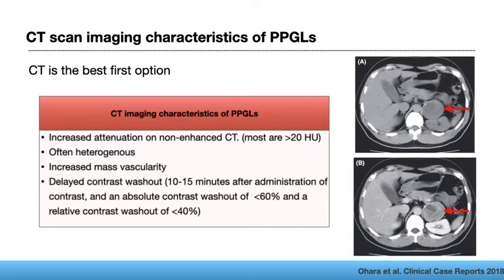The last characteristic is the delayed contrast washout, with the absolute contrast washout of less than 60% and the relative contrast washout of less than 40%, 10 to 15 minutes after administration of the contrast. And I will discuss this in the next slide.